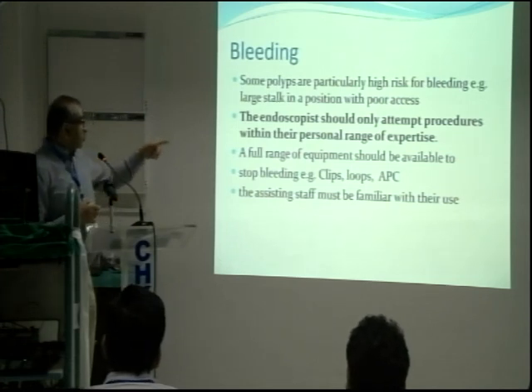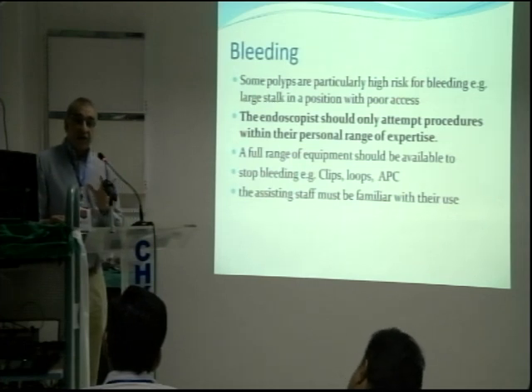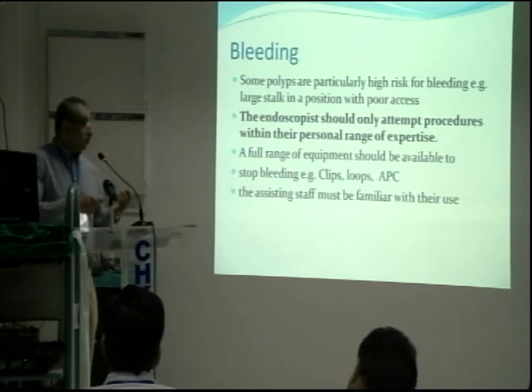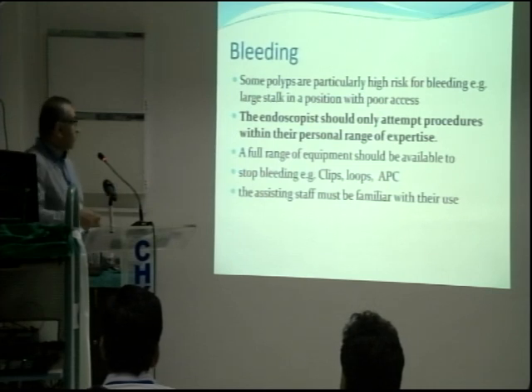So always make sure that you are qualified to do that polypectomy. The endoscopist should only attempt procedures within their personal range of expertise. There's a saying in English, don't punch above your weight. If you are a middleweight boxer and you start fighting a heavyweight, then obviously he'll beat the hell out of you. So don't try to do procedures which are not within your range of expertise.